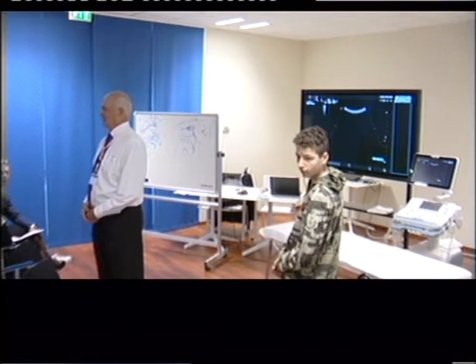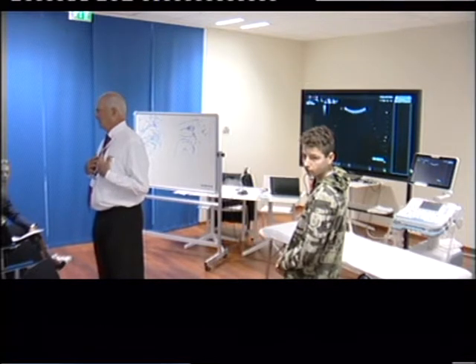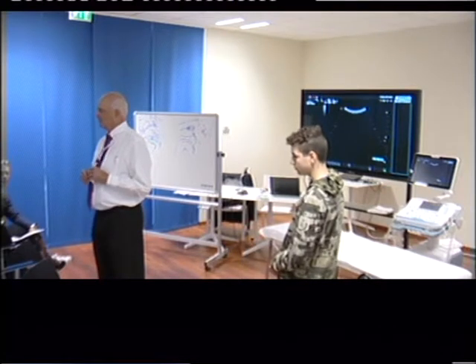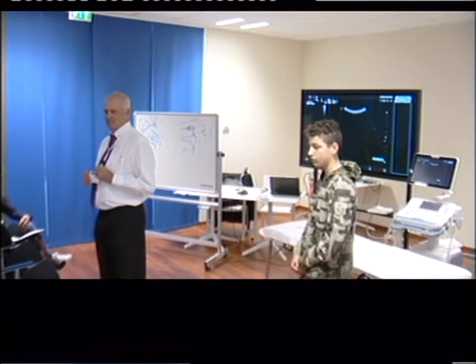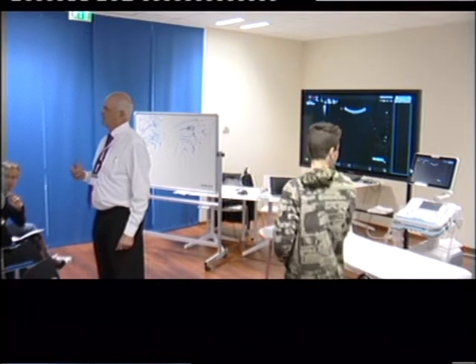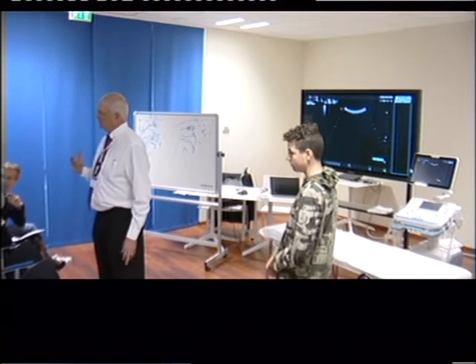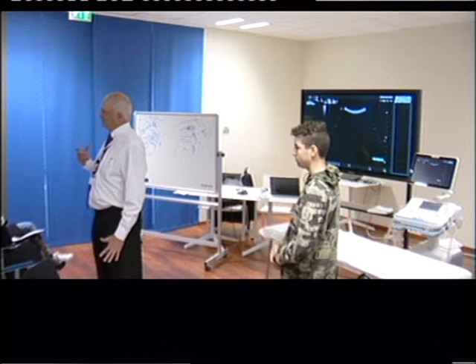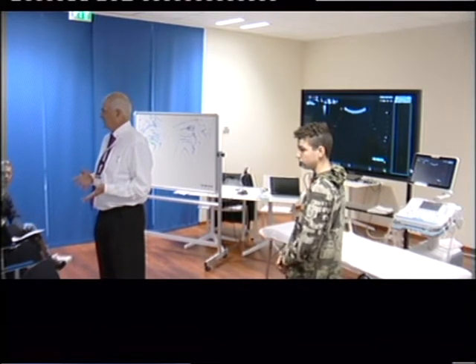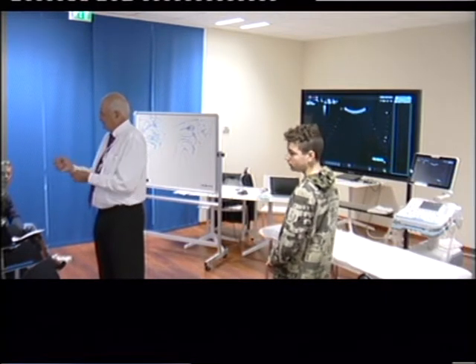But again, I made this word up 25 years ago called hydrodissection. The technique frees the nerve from its surroundings. You push 10 cc's, 15 cc's, 20 cc's, maybe of just 5% dextrose, maybe just saline with a little bit of lidocaine, maybe a little bit of steroids, but it's mostly volume.